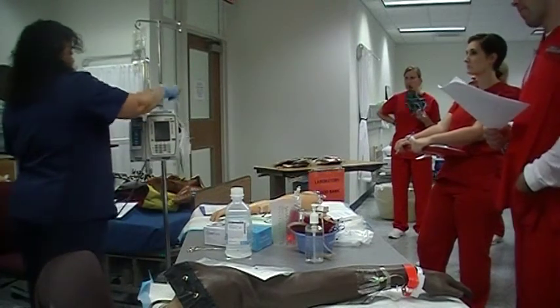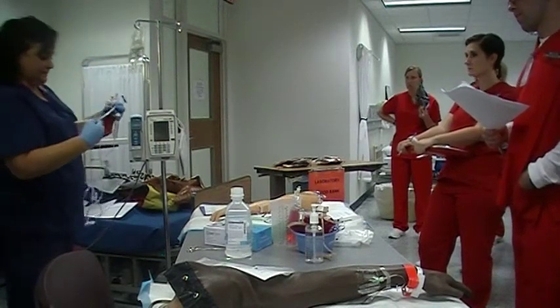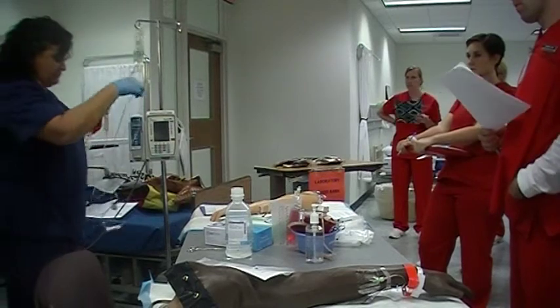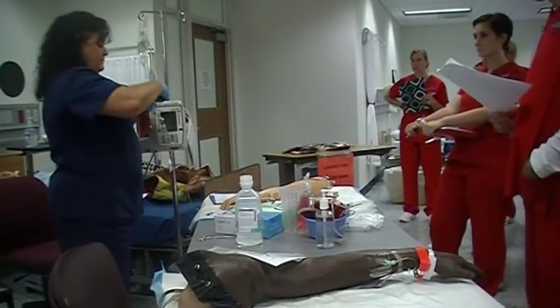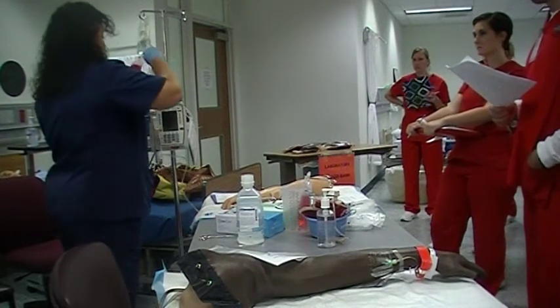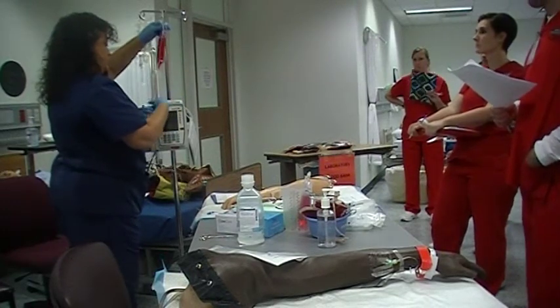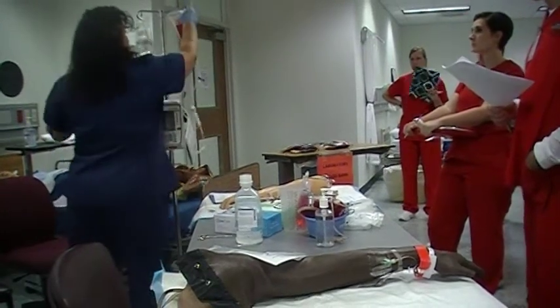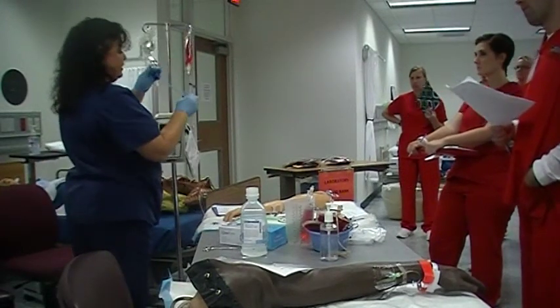So you want to go to your other port. It's still clamped off. Spike your blood. So we want to leave this saline closed.